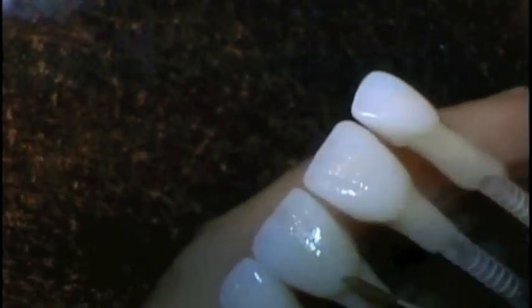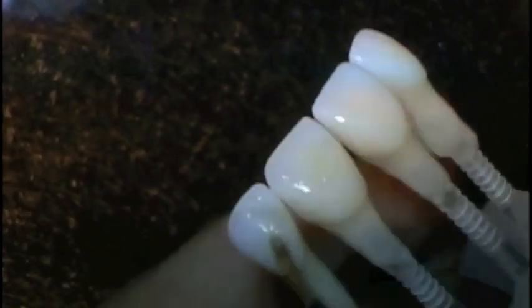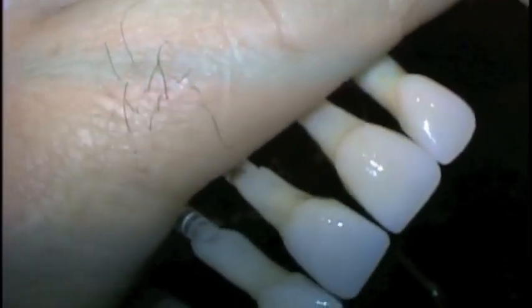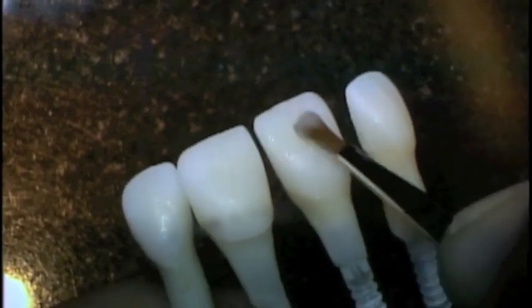And as we blend our stains for good color gradation, we'll go ahead and do that to all of the teeth. And then we'll come in with a little incisal blue for translucency simulation. Remember, the opal ingot already has a lot of translucency. So I'll just enhance that a little bit.